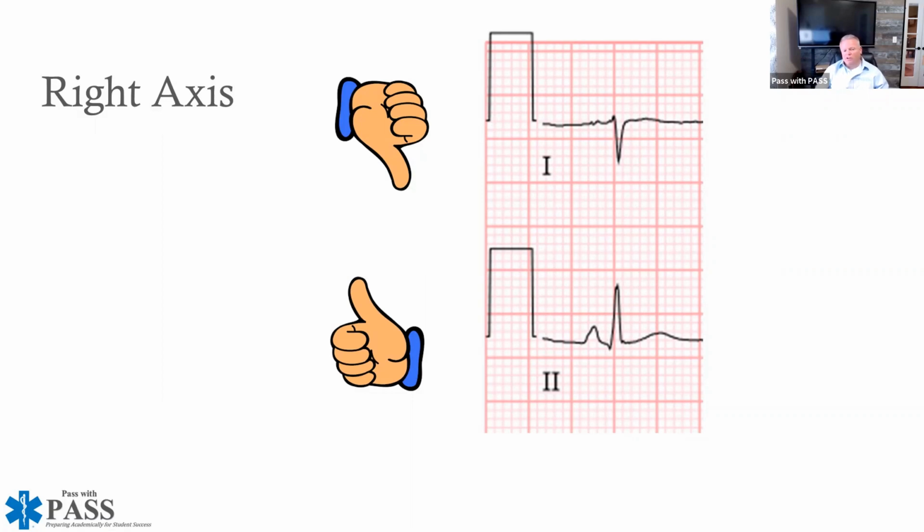So kind of ask the question here, and again, not necessarily looking for a response, but if I simply did that, I have my leads on correctly, I do an EKG, and I use 1 and 2, and I do this and this, and I say they're heading right towards each other, giving me a right axis deviation. What are some conditions that this patient may be suffering from?